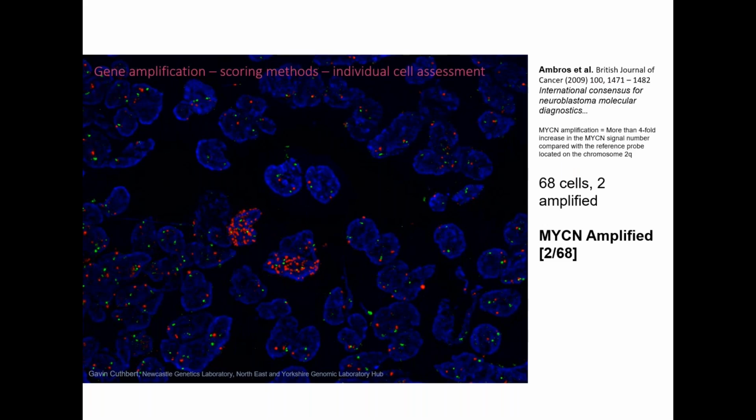So we tend to score on an individual cell by cell basis. That's the key difference of those ABC guidelines, is you would look at each cell and decide whether or not it's amplified. Not, is this cell amplified or not, way of doing it. Clearly 2 are. I reckon on that screen there's 68 cells, 2 of which are amplified. So that's the way I would describe that, as MYCN amplified in 2 cells. It's heterogeneous, you know, whether or not that's the same significance as if it was homogeneous, different story.